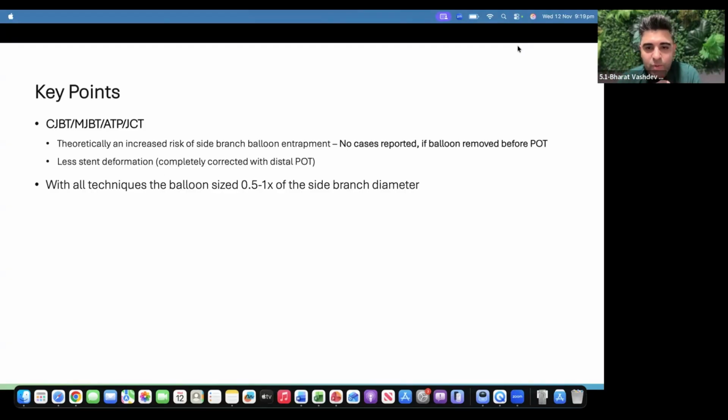These are techniques you need to be quite familiar with, of course, before you start engaging with these slightly more advanced techniques. And yes, you're right. When you do withdraw the balloon, there is a little bit of resistance as well. So you have to keep an eye on the distal wire. You have to keep an eye on the guide to make sure it's not diving in. And if you're doing something involving the left main, for example, then you probably want to avoid LSD of the proximal stent edge as well, by the guide hitting it. So there's a lot of technicalities to it.